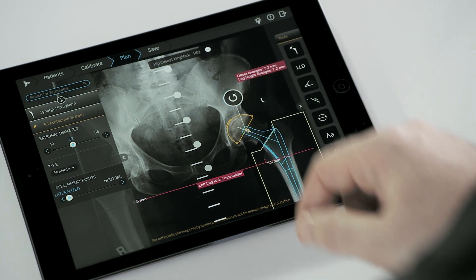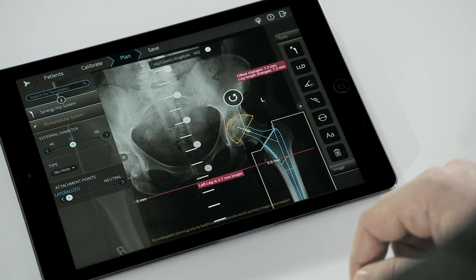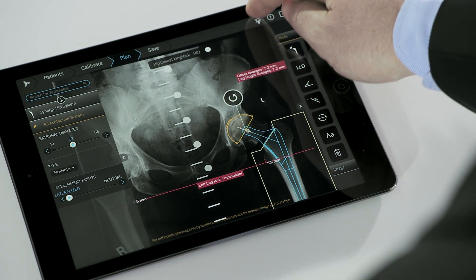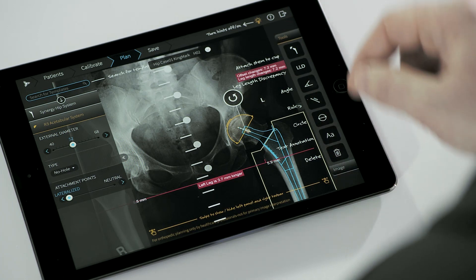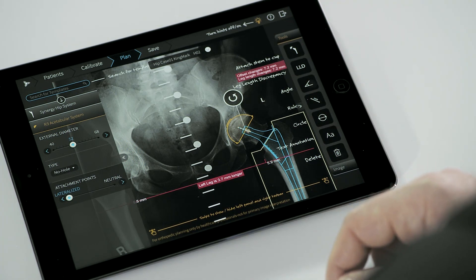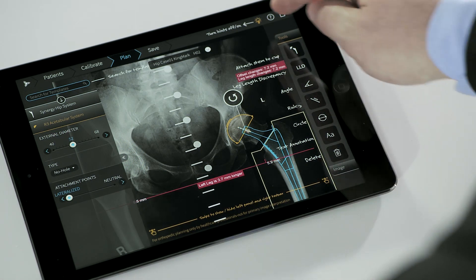Individual components can be changed and the impact on leg length and offset is shown. Hints can be turned on or off at any stage of the planning for additional guidance.